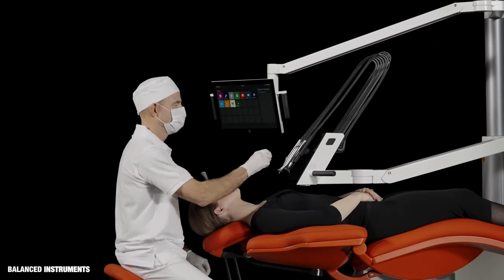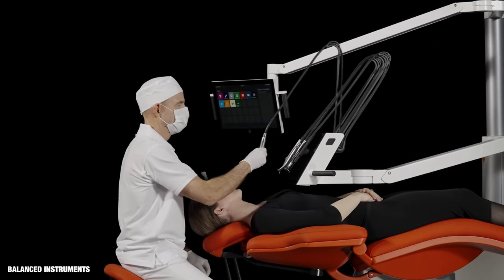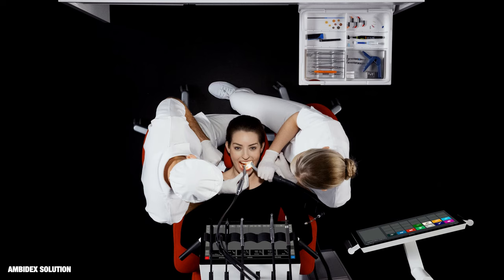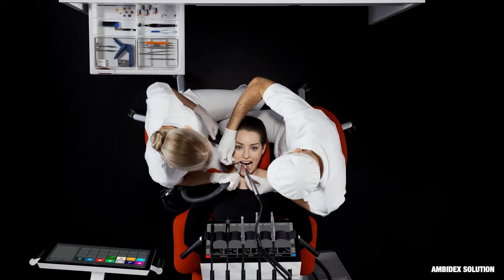The Ergonomy Guide app offers guidance on healthy and optimal working positions. Practitioners can focus on the patient and avoid strain on fingers, hands, arms, and shoulders. It takes less than 20 seconds to convert ExoFlow from right-handed to left-handed operation — just reposition the suction hose holder, the navigator, and the delivery plates in ExoWorktop.